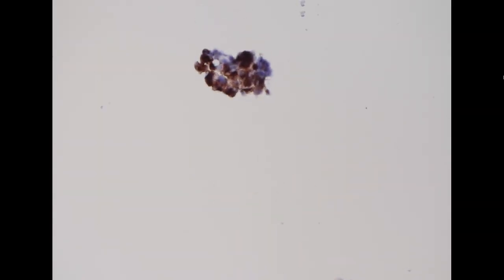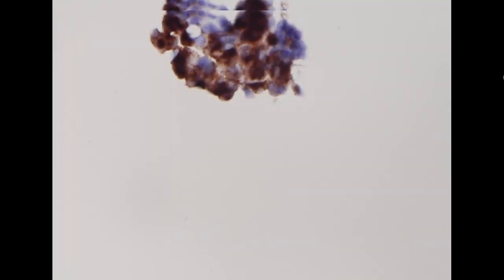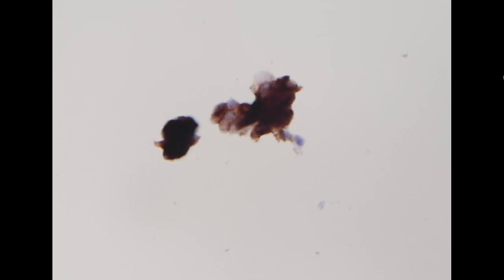If it is a medullary thyroid carcinoma, you will see cytoplasmic expression of calcitonin, which is negative. Additionally, we also did thyroglobulin. You can see most of the cells showing cytoplasmic expression of thyroglobulin, which suggests that the origin of these cells is follicular cell instead of C cell.